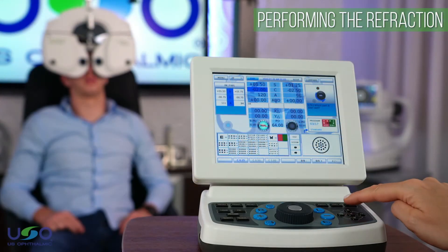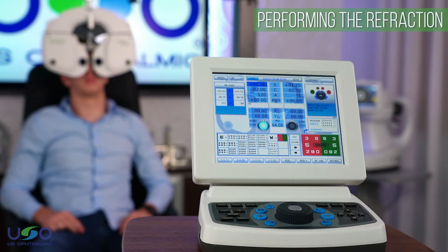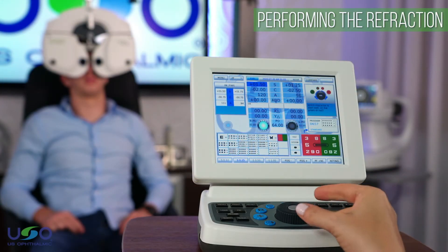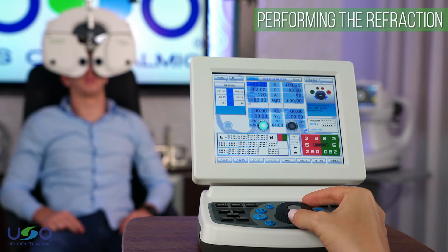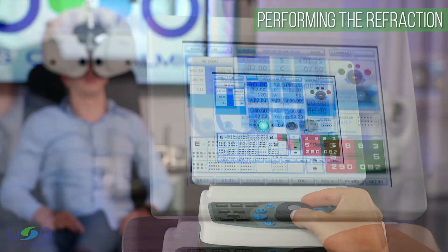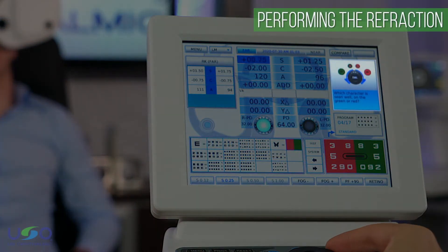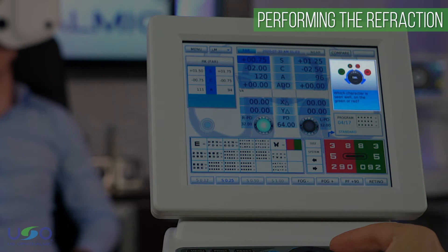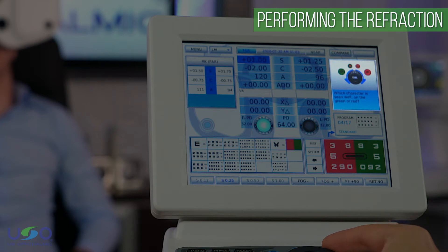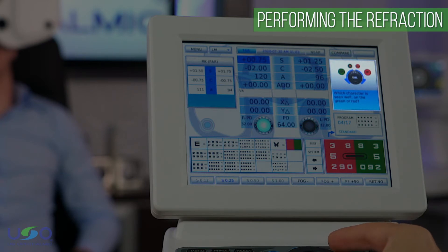The evaluation for overcorrection or undercorrection is performed by selecting the red and green test. In the case of an imbalance, the guide window indicates in which direction to rotate the knob to make the appropriate correction in the spherical power.